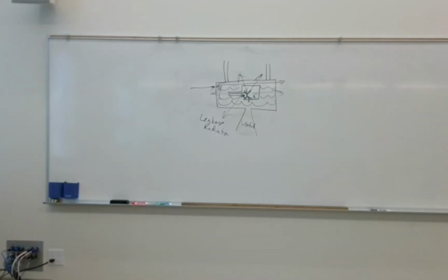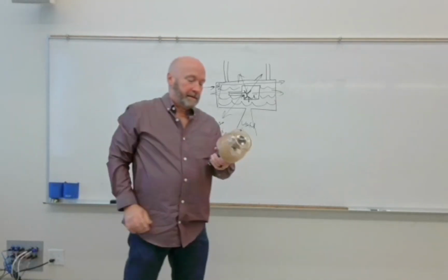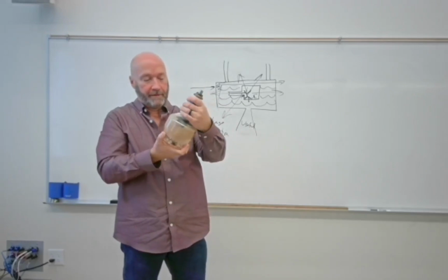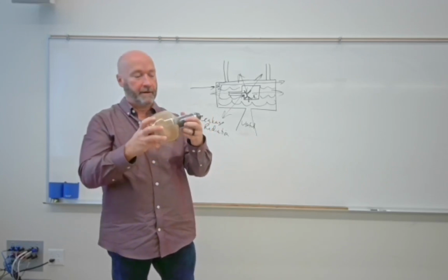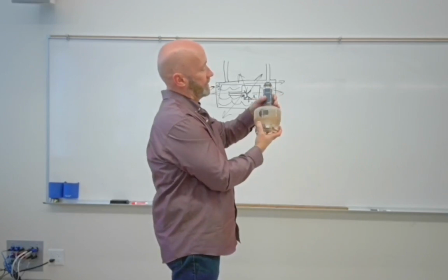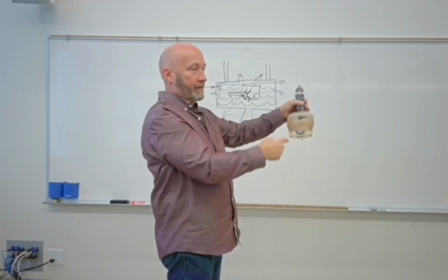A few things before I pass it around that I want you to pay attention to. Rotate this thing around to where you can see the cathode. The cathode is the part that does not rotate. Can you kind of see that little dot right there?